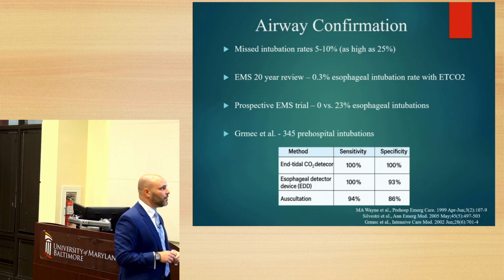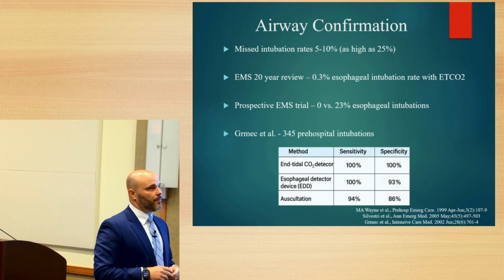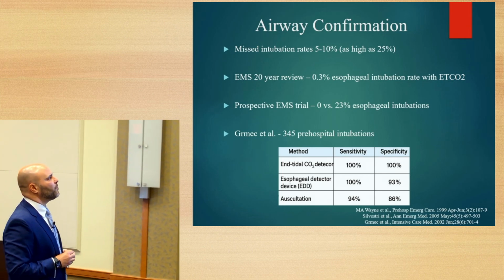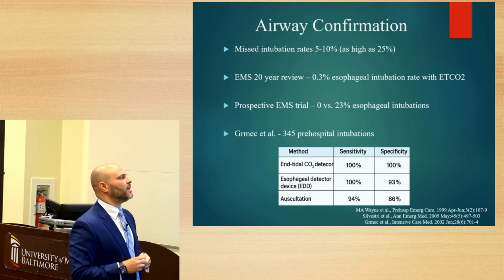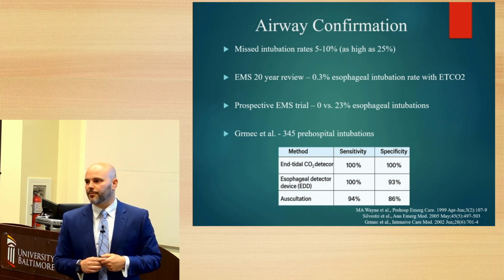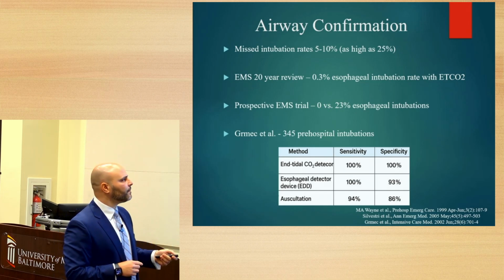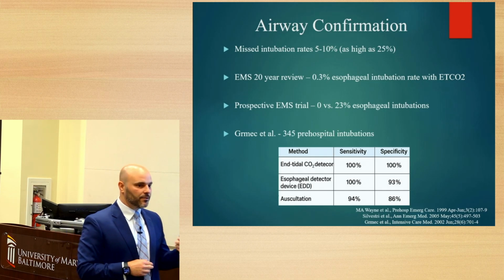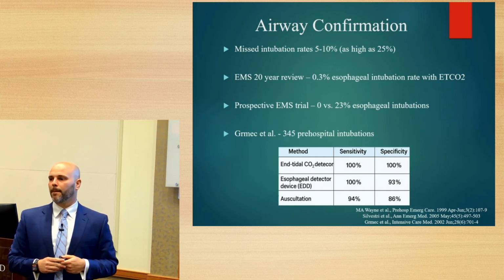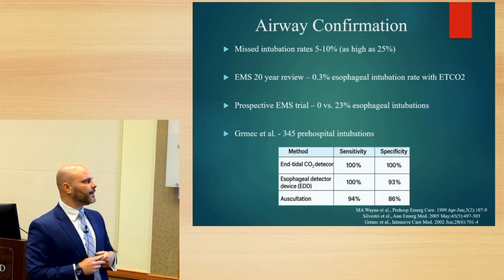And there are some studies showing that, reviewing a large EMS body of evidence with pre-hospitalization intubation, esophageal intubation rates decreased to 0.3% using end-tidal CO2 to confirm placement. And then an EMS trial showing 0 missed intubations versus 23% missed intubations when not using end-tidal.